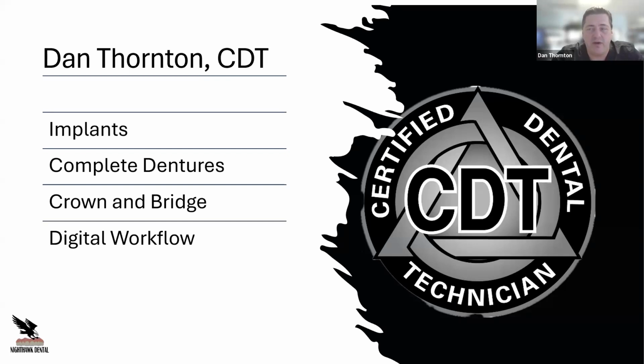Now, just in your mind, if you do the smart conversions, when you get the kit, they give you a model and a denture to try out to see how it works before you actually go live with a surgery. So you can play with it before you even get to surgery, so you know what to expect and what to look for.